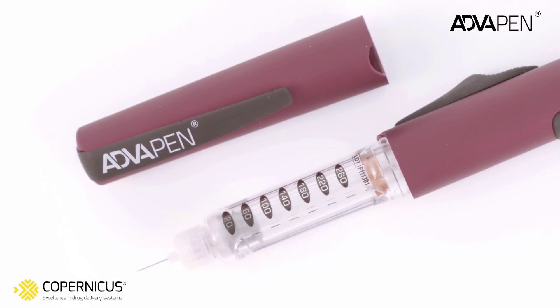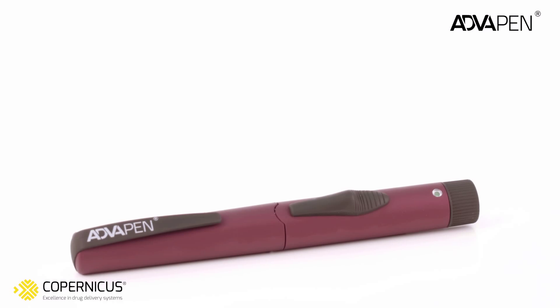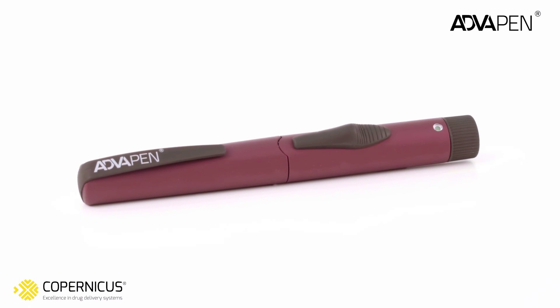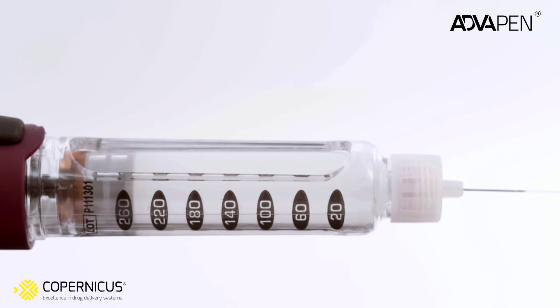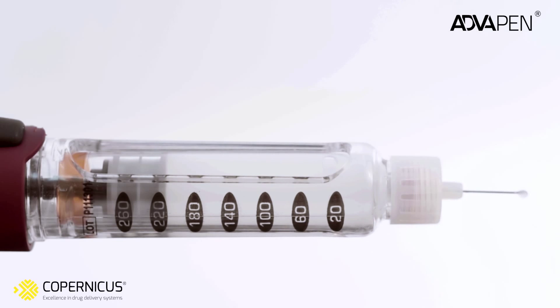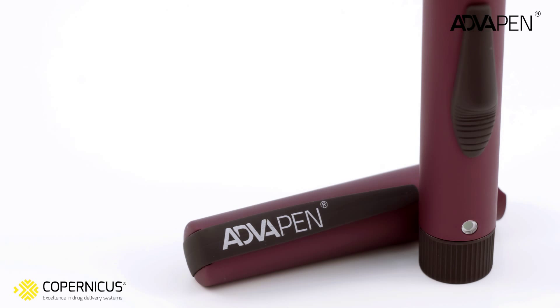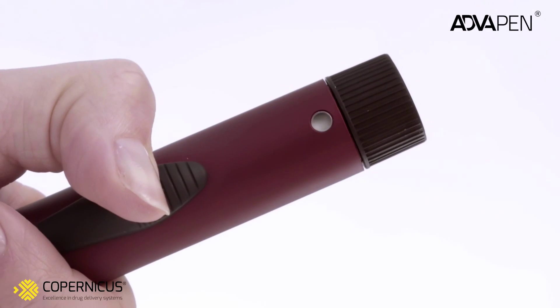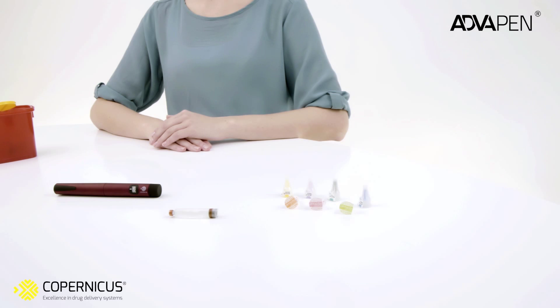Welcome to this quick guide which will instruct you how to use the automatic insulin pen injector by Copernicus. This pen offers an easy and safe method of accurate dosing of insulin. The automatic spring-assisted delivery system enables an effortless injection of the desired dose at constant speed, regardless of dose size. The release button is positioned at the side of the pen body, making it easy to reach and allowing you to firmly position your hand during injection.